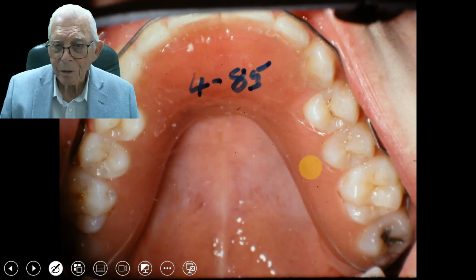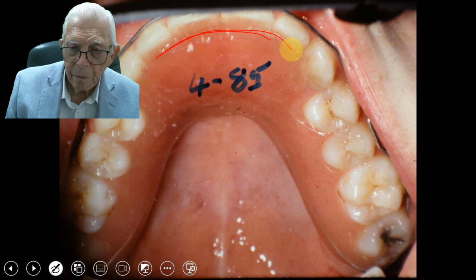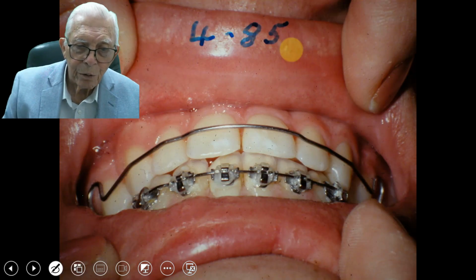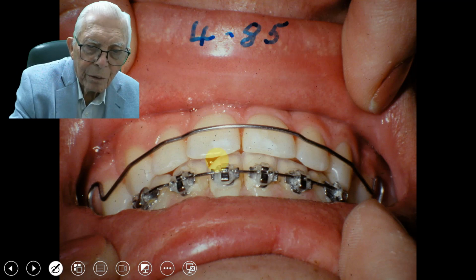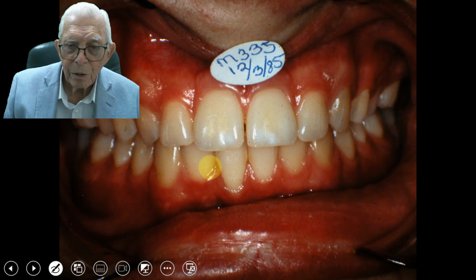Now this is his upper retainer with a little bite plate. You see the teeth fit in right there. Now that's that tooth. I don't know what's happened here. You've got either his tongue or a chip or something on that tooth. But there it is, finished case.